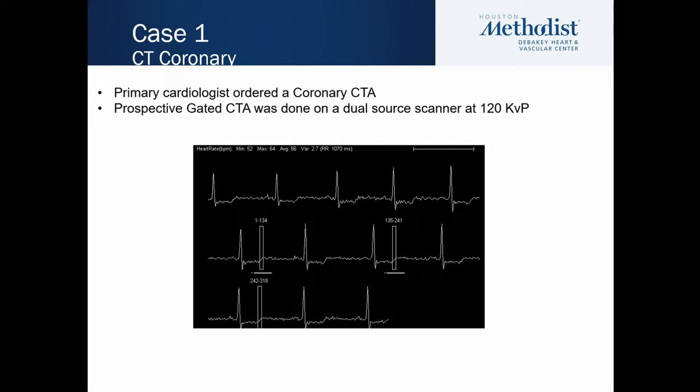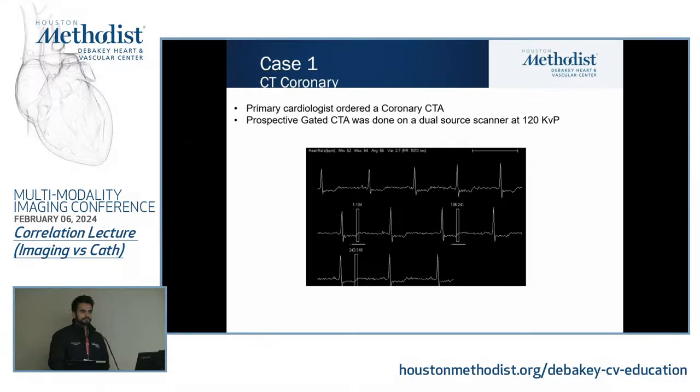That's actually a question right now. There are a few papers right now where people are switching to have systolic as their standard, because in end-systole you're getting better RCA imaging, so there might be merit to doing routine end-systolic imaging. Yes, and I think in this situation it's about trying to catch the best image. What's your best bang for your buck?